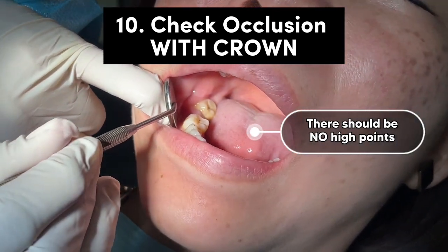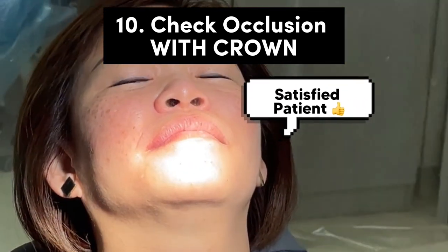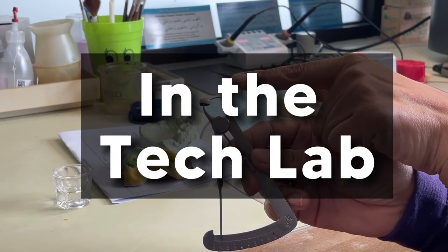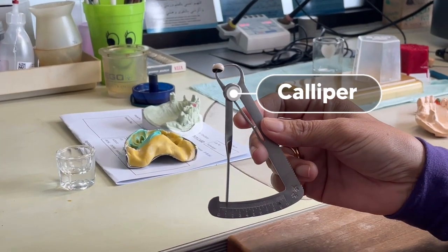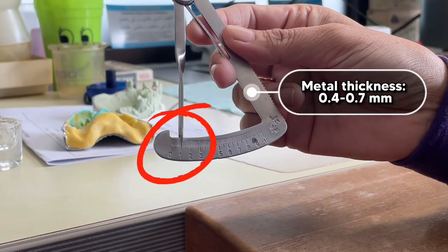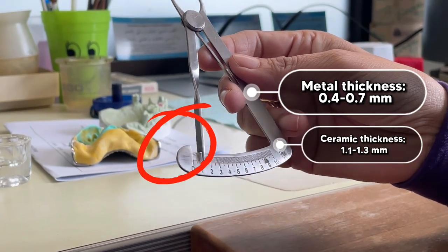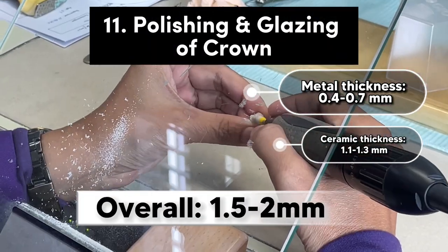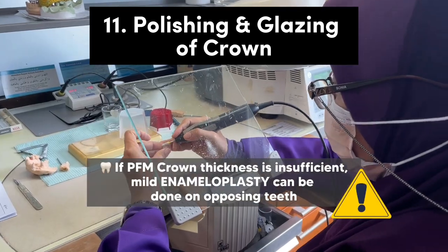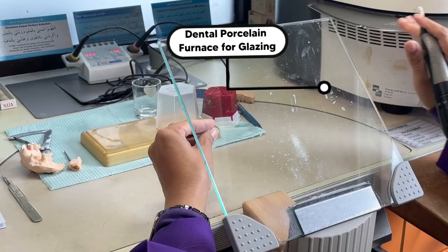Once the occlusion is completed and both the patient and clinician are satisfied, you stop trimming and proceed to crown polishing. A caliper is used to check the thickness — for PFM, we keep the metal thickness at 0.4 to 0.7 mm, with the remaining being ceramic thickness, giving an ultimate total of 1.5 to 2 mm. Based on that measurement, we trim whatever is required, then proceed to final polishing and glazing of the crown, which takes about 30 minutes.